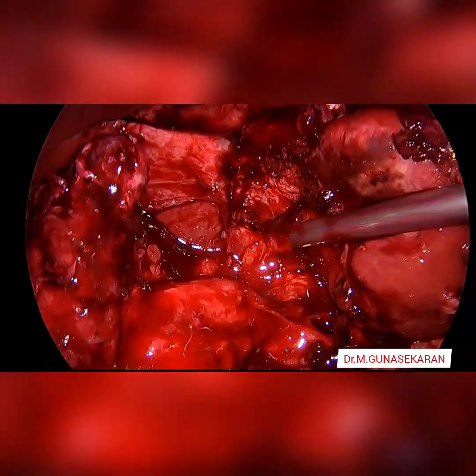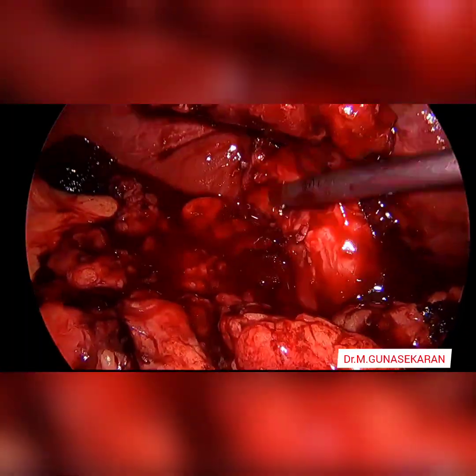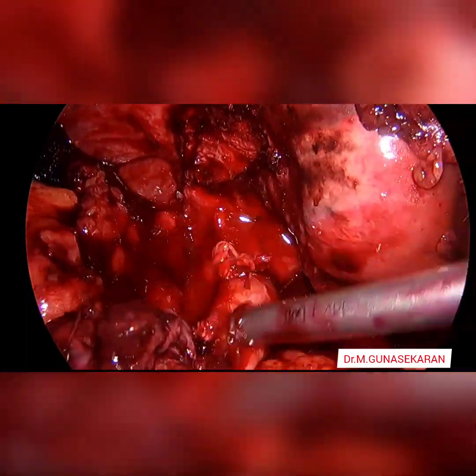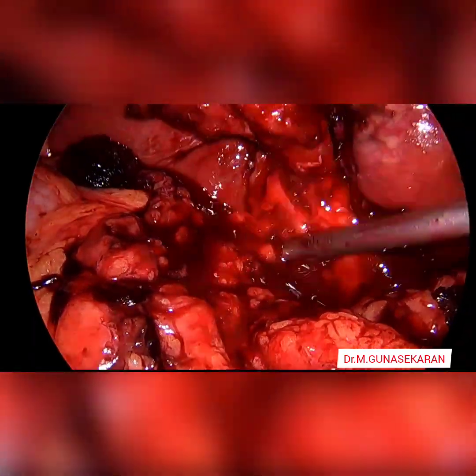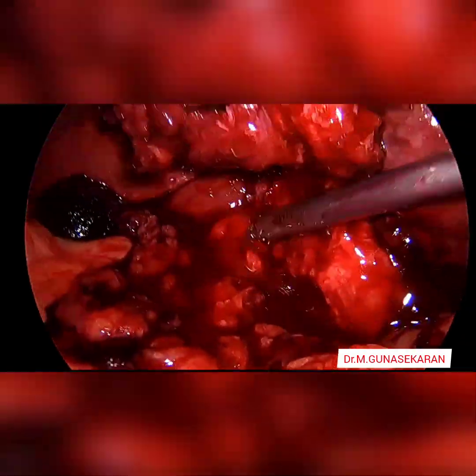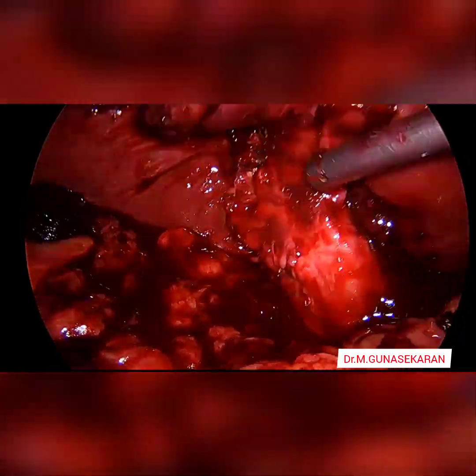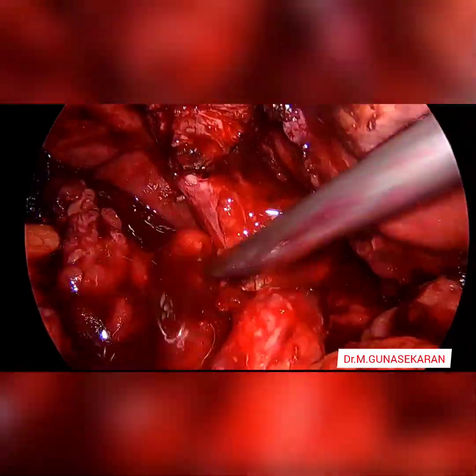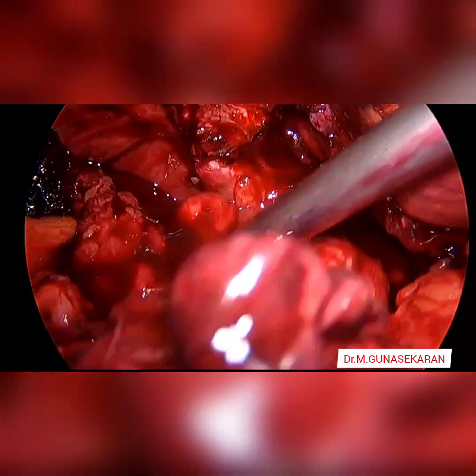I am now dissecting the cystic duct. The cystic duct is short, wide, and broad in nature. You can appreciate that the cystic duct is attached to the common bile duct, with some other structures entering the gallbladder. The cystic duct is now completely divided.